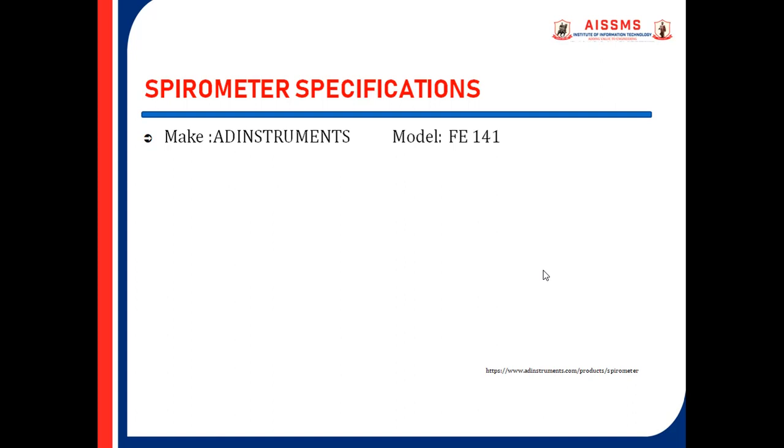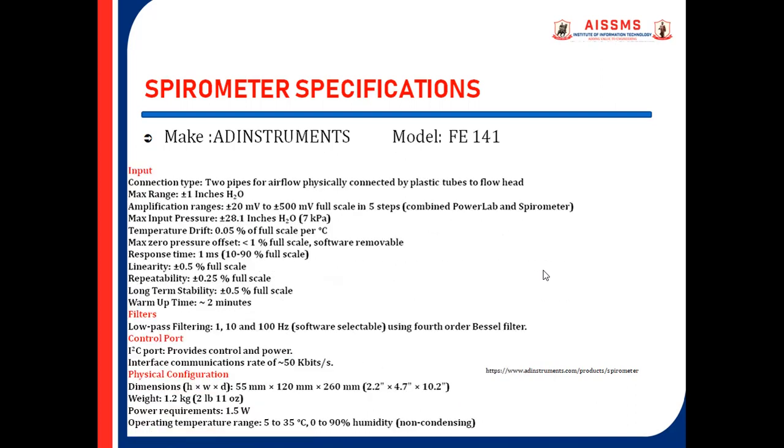Now we will see the specifications of the spirometer. Make: AD Instruments, model FE141. So these are the listed specifications of the spirometer with the model.